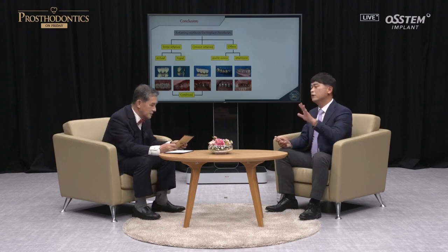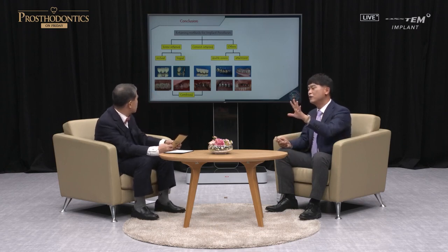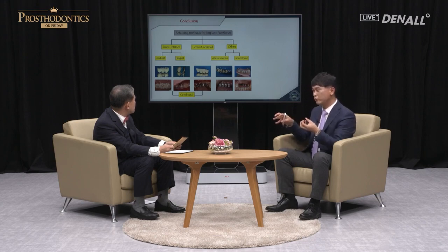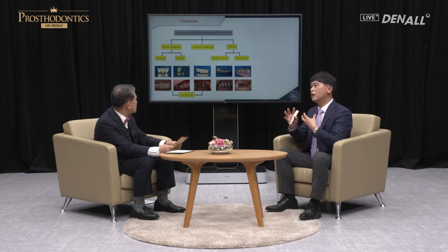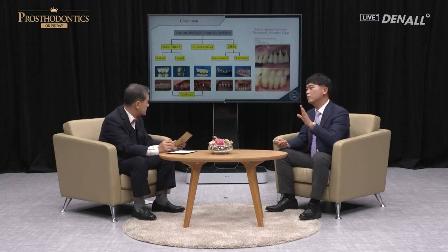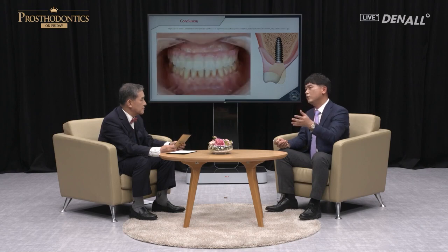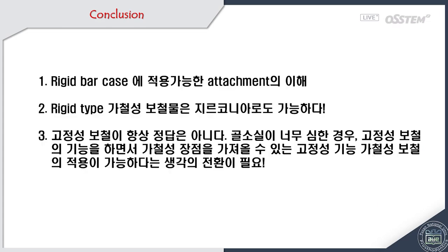Let me reach a conclusion. This is an old slide. Professor Chongchano allowed me to use this slide. This is professor's classification. What I'm saying here is not a new concept. Newly developed materials and attachment are used over the existing device, so it is a further improvement on the existing device. To reduce the complications, we came up with prosthesis that is in the middle. So we are not extending denture base completely, it is just slightly covering in the form.